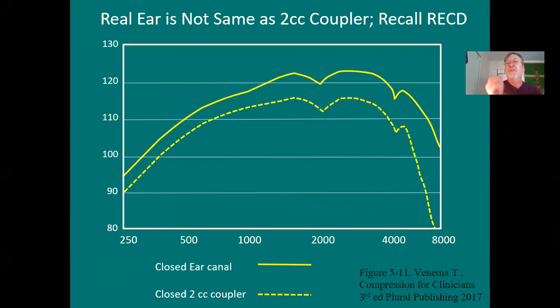What about the real ear? Okay, hence real ear measurement, because now you're looking at the ear on Ted as opposed to the ear on Matthew, as opposed to the hearing aid on Grace. I mean, different people, different ear canals. Real ear measurement takes the individual person into account, not just the generic human race.